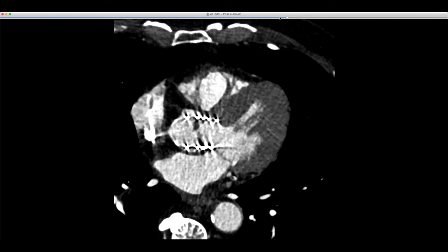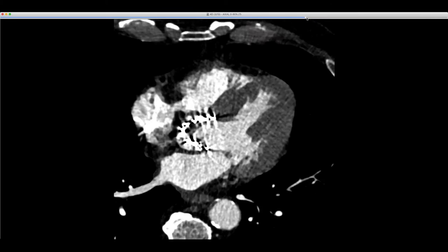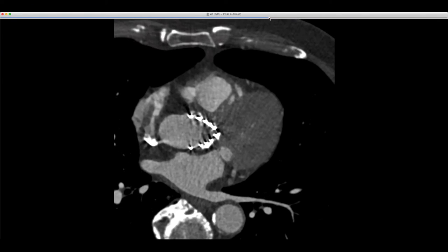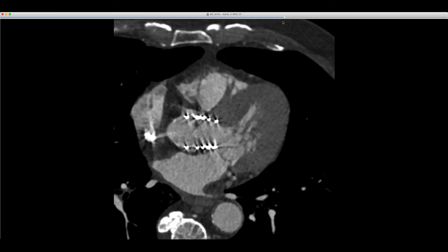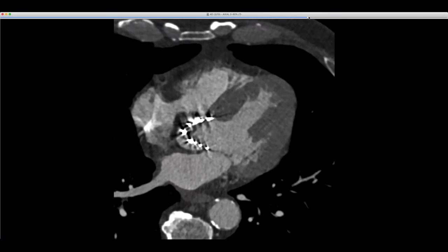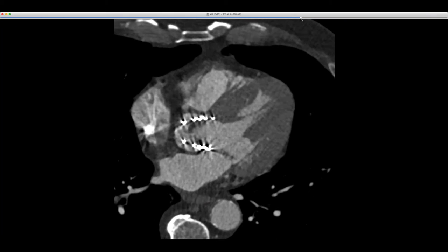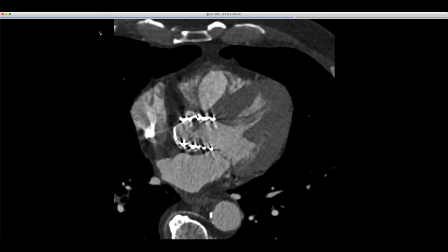Okay, I have a few cases here. This is the first case, if you can see the screen. I'm presenting another case of a transcatheter aortic valve. This was an Edwards Sapien valve. We're doing a fair amount of post-TAVI imaging now, both routinely for various studies and also if there's a gradient across the valve. This patient did have a significant gradient across the aortic valve, so an indication here is to look for thrombus and valve leaflet mobility.